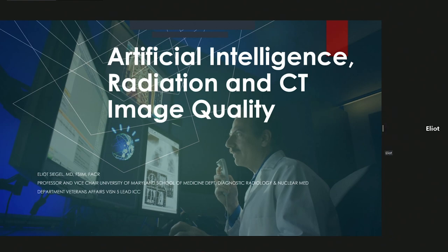Yeah, so those are two huge questions. As far as oversights for AI, there are very little oversights now for AI for image quality assessment, but in particular for a deep learning reconstruction. And as far as how one determines errors in image interpretation, that can be very difficult because there's a variety of different opinions by different radiologists, and it's hard to have a gold standard. And so I think the challenge that we have is, even if we could have quality assessment, it may vary according to whether it's a neuro study, chest study, body study, et cetera.